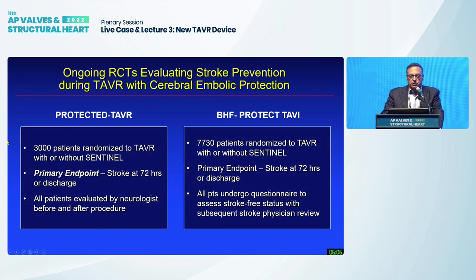There are two major ongoing randomized trials, one in the United States and one in the UK, that are really designed to test this question. One is called Protected TAVR, the other is called the BHF Protect TAVI. The Protected TAVR trial, I'm pleased to report, is going to be presented at the TCT meeting in about 6 weeks, and so we will get a lot closer to the final answer here.